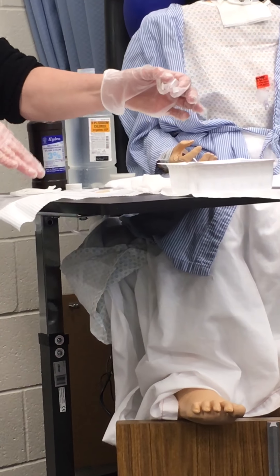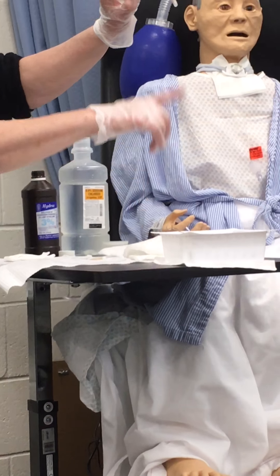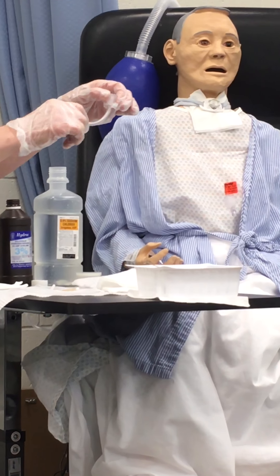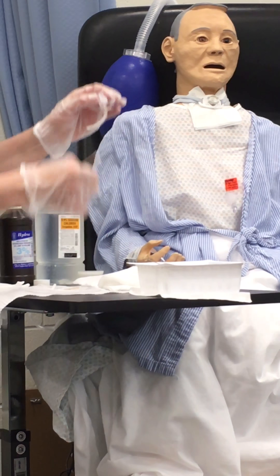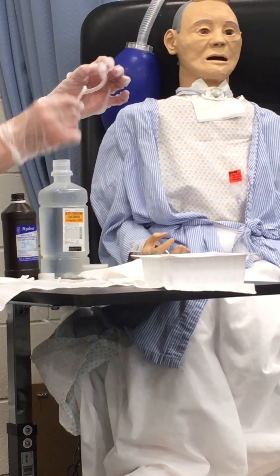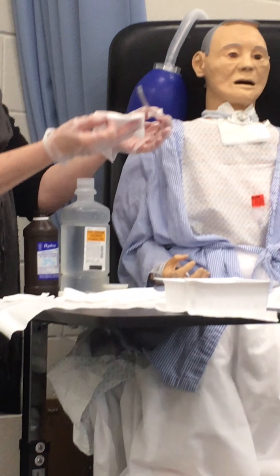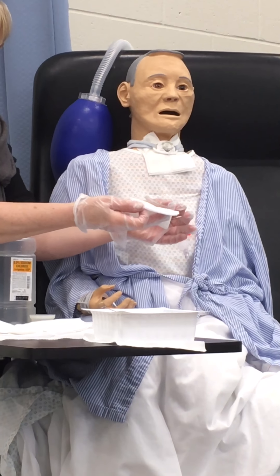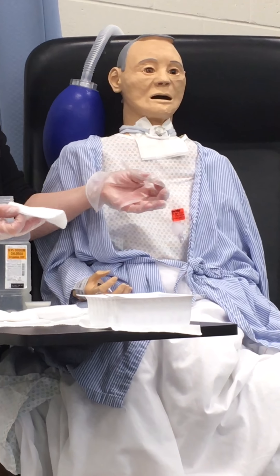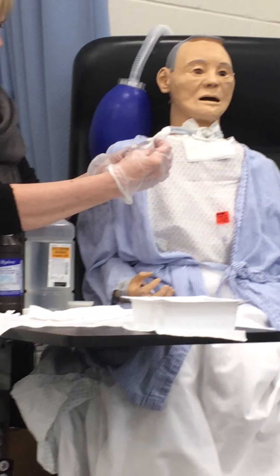Drying — it's okay to set stuff here. You can dry with this on the outside, but some patients cough when they have that on the inside, so that's what all these are for. You might use that Q-tip — just don't get anything stuck in there. Do the best you can. Clean around. And then just letting the patient have some control — I say, do you want to look at that? Kind of offer it: does that look okay? People feel like this is a condition where there is no control, so that's sometimes nice to do. Also, it keeps me sterile if I happen to mess up.